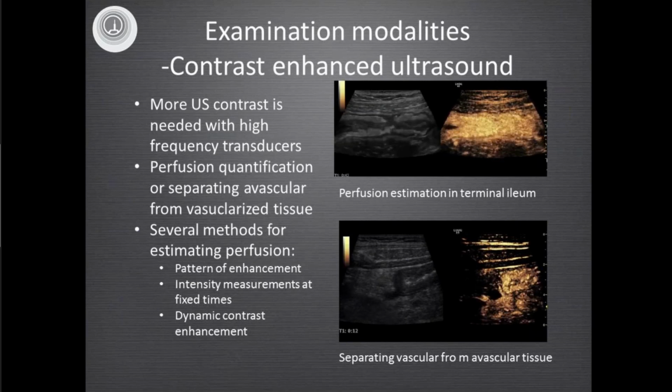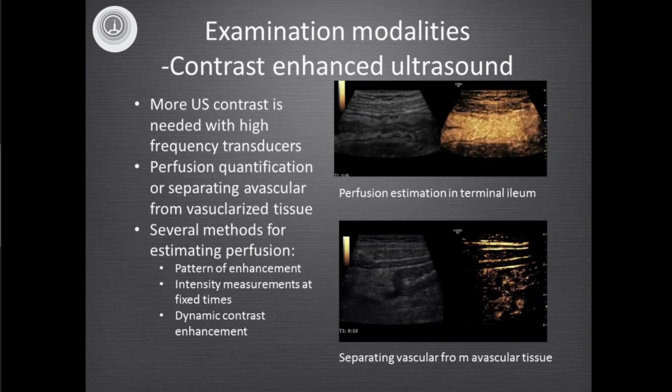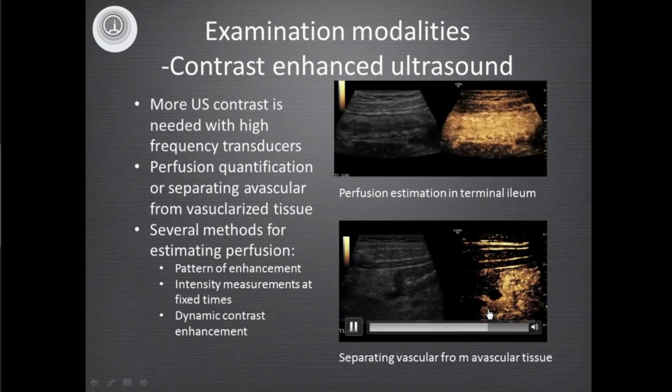It can, however, be tricky to analyze, but I'm sure that Kala Sara will talk more about this later. Above, you can see the perfusion in the GI wall in the Crohn's patients, and below an avascular area, also in the Crohn's patients.